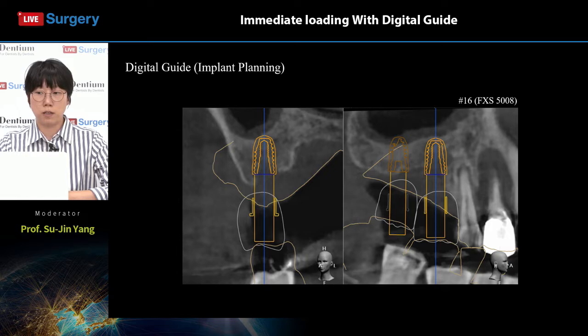positioning both implants deeply so they are positioned into the patient's bony housing results in longer crown height space, that is, worsening the crown to root ratio. The pros and cons can be considered, and which position the implant should be placed in is a factor that the dentist can decide.